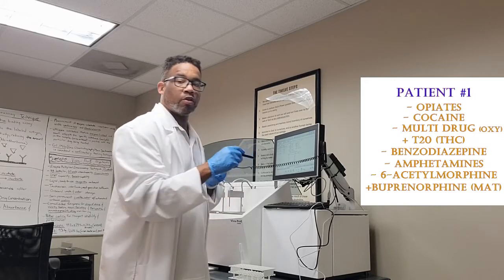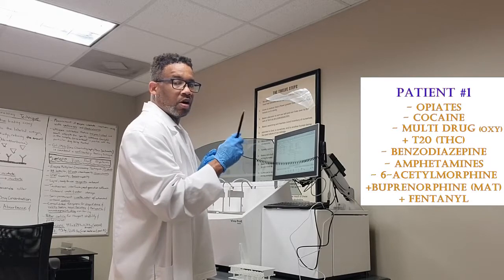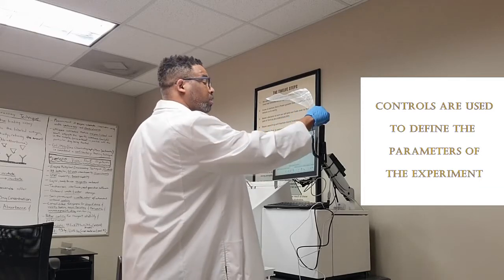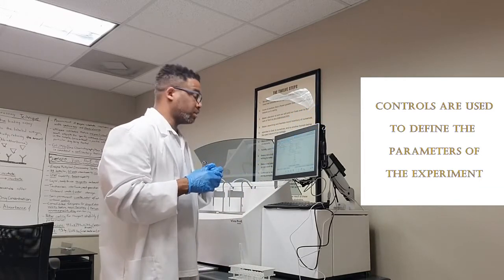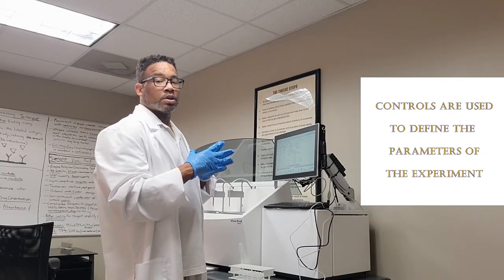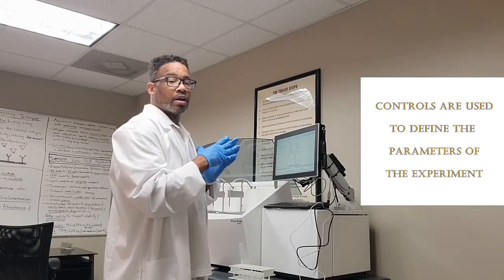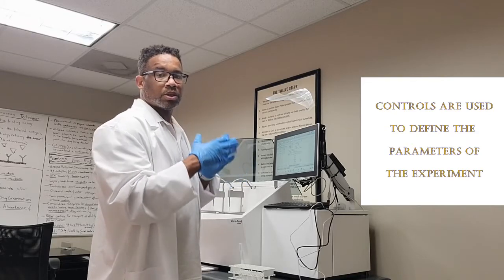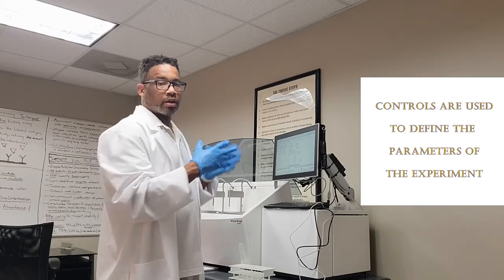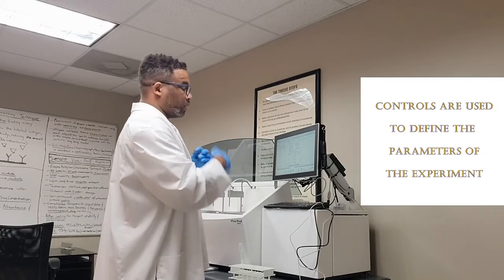And we have positive for fentanyl. So fentanyl was positive on this patient on the machine, but our control, our instant, said it was negative. So it might be user error. It might be that the test was misread and we might have got a false positive here, or we could have got a false negative on the strip test. But tomorrow we will try to find another sample that we can get a more accurate read on when it comes to our controls, then we can test it against it.